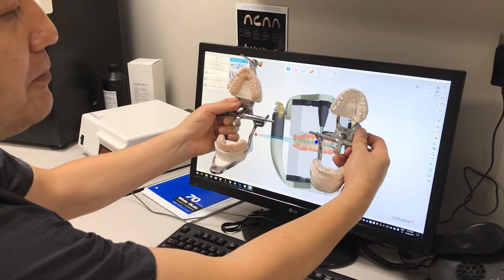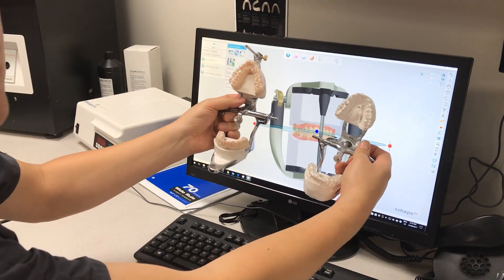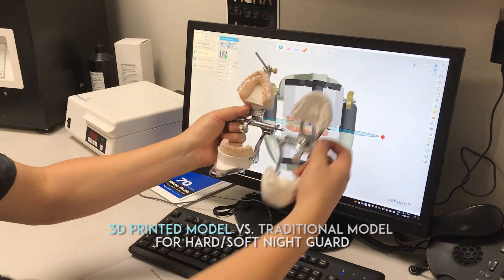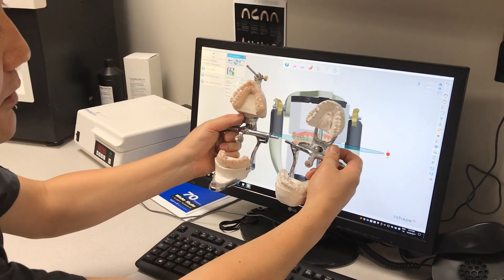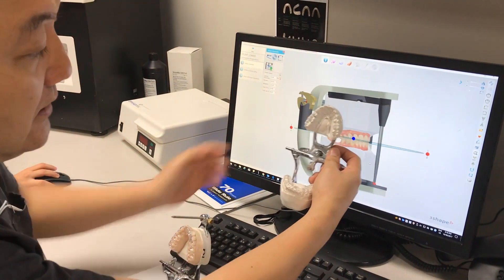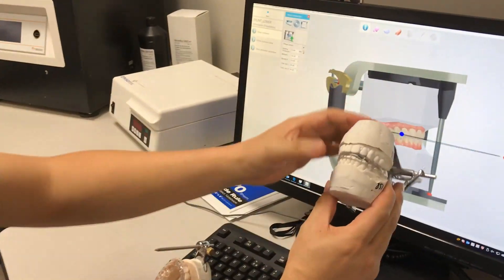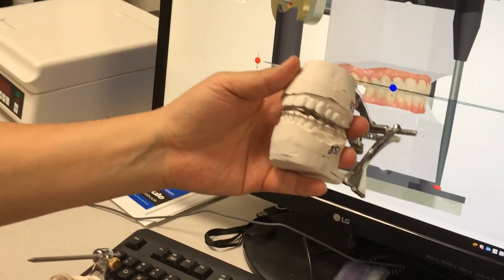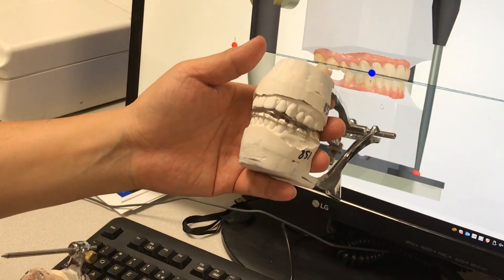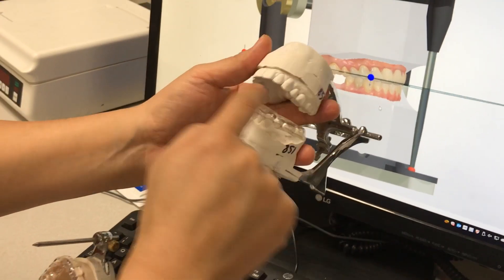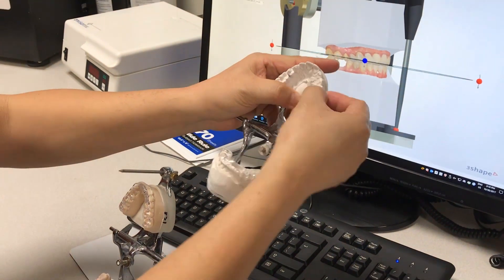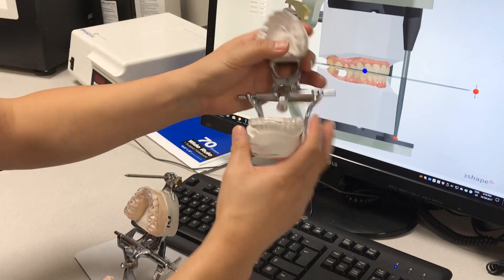I'd like to explain what is different between the traditional model compared to the printed model. The printed model is the best. The problem with the traditional model is — we just finished it — here's the impression. I see so many discrepancies between the models: slight bubbles here and there that we have to take out, slight cutoff discrepancies.